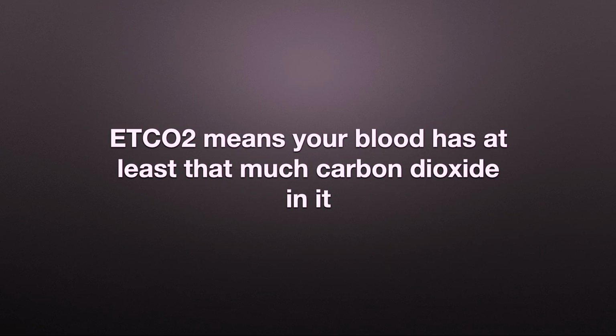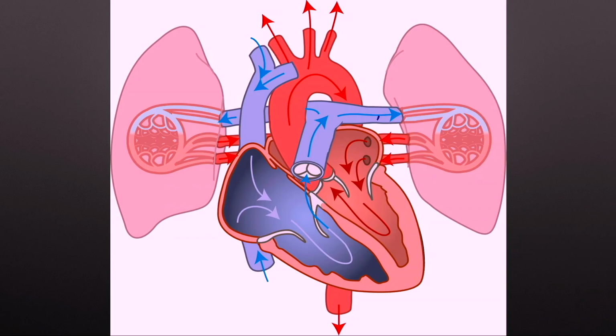It's also worth noting that end tidal CO2 measurement only means that your blood has at least that much carbon dioxide in it. Because as I mentioned before, there's a big pathway between your blood and the actual outside world itself. End tidal CO2 can't be higher than the dissolved concentration of CO2 in your blood, but it certainly can be lower. And so you really don't know.